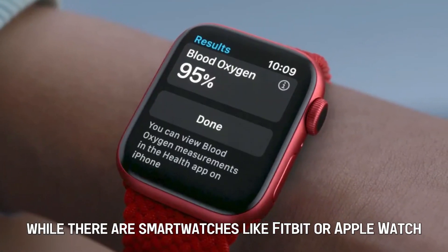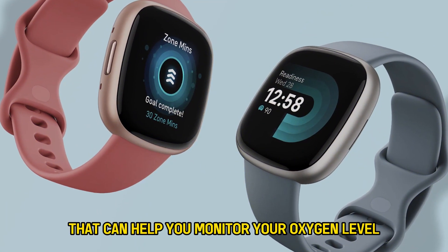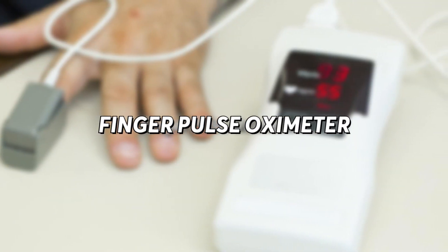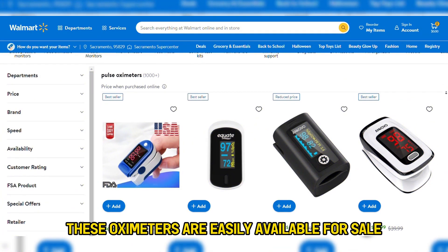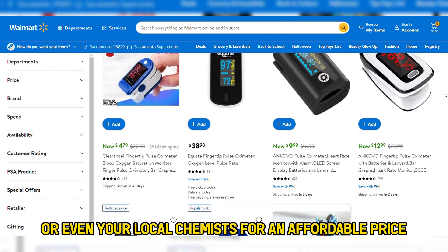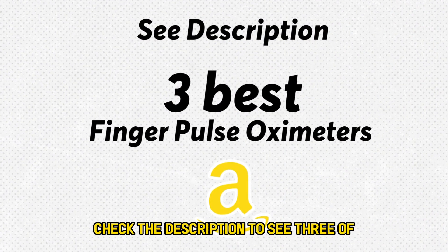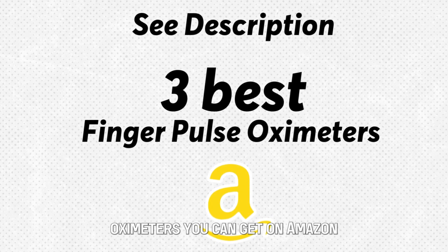While there are smartwatches like Fitbit or Apple Watch that can help you monitor your oxygen level, medical professionals advise using a finger pulse oximeter for the most accurate results. These oximeters are easily available on online platforms like Amazon or even your local chemists for an affordable price. Check the description to see three of the most recommended finger pulse oximeters you can get on Amazon.